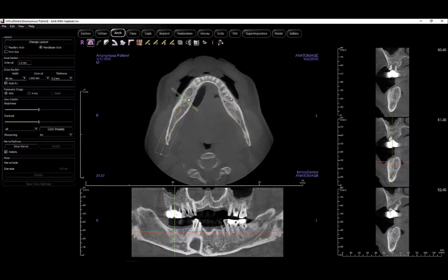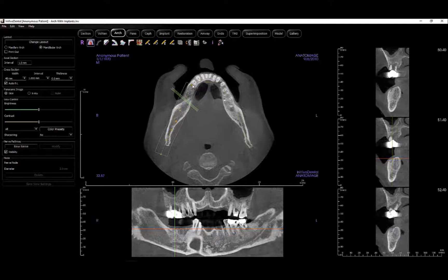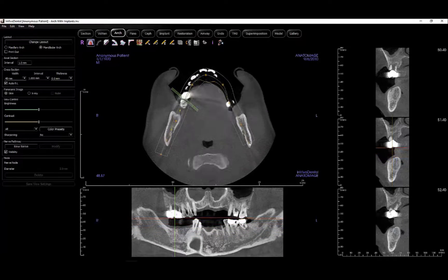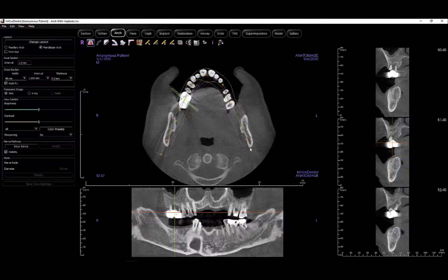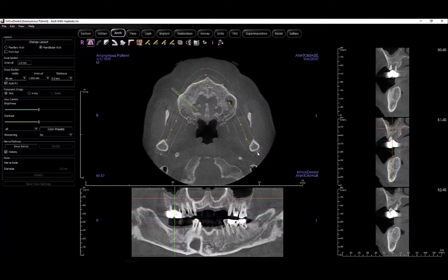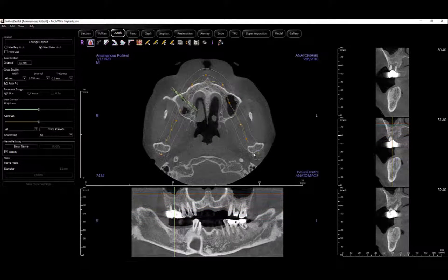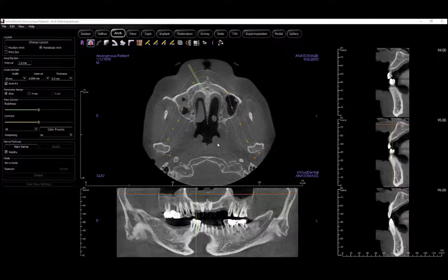In generating the arch spline, you should place five to seven points along the arch, but you can include as many as you'd like. After placing the last point, right-click to finish the object.